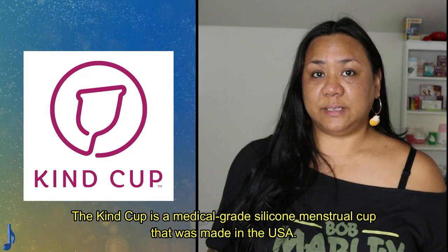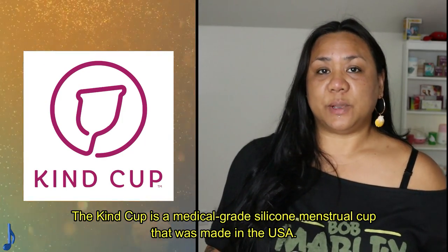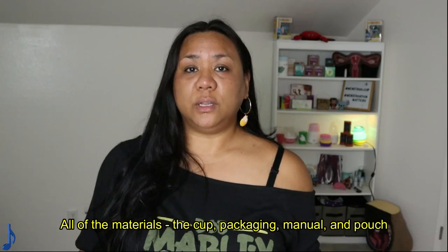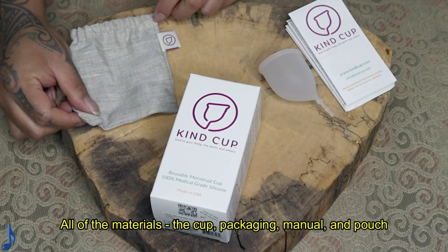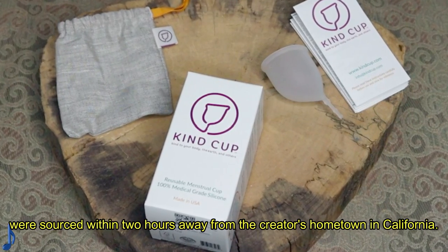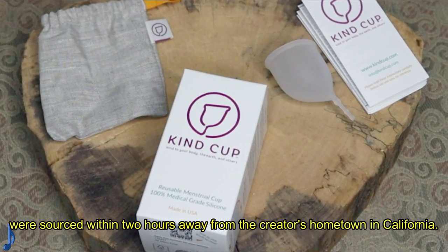The Kind Cup is a medical grade silicone menstrual cup that was made in the USA. All of the materials — the cup, packaging, manual and pouch — were sourced within two hours away from the creator's hometown in California.